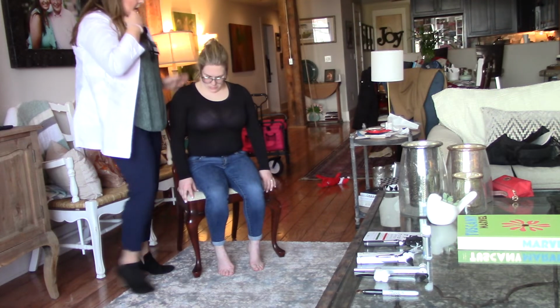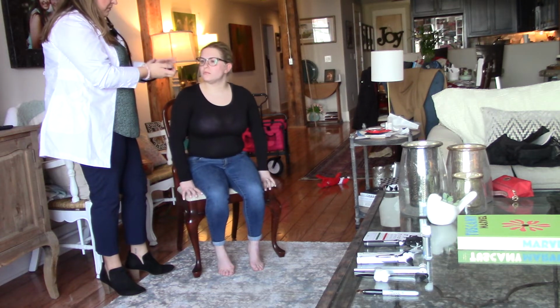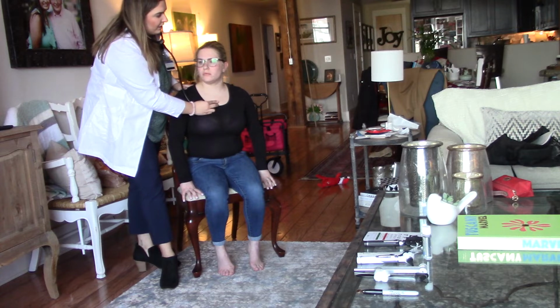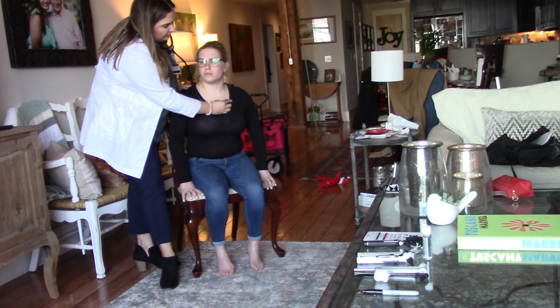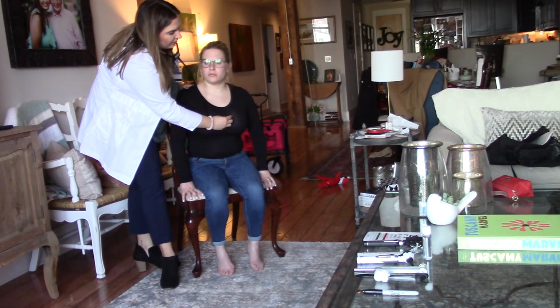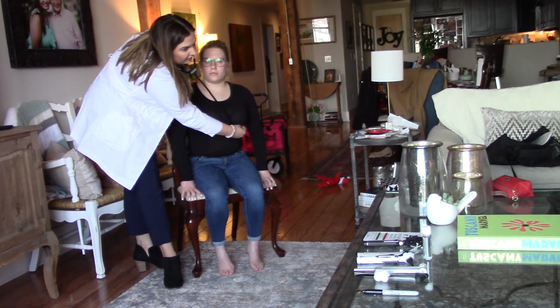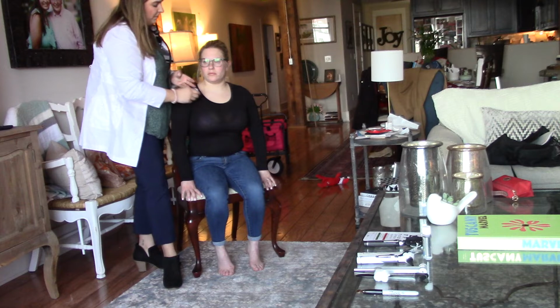Great. I'm now going to move on to my cardiac assessment, and I'm going to begin by auscultating your valves, starting with the aortic valve, which is at the second intercostal space right sternal border, pulmonic valve, which is at the second intercostal space left sternal border, Erb's point, which is at the third intercostal space left sternal border, tricuspid, which is at the fourth intercostal space left sternal border, and then your mitral, which is at your fifth intercostal space midclavicular line.